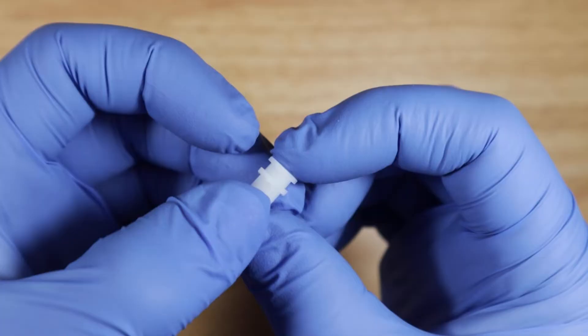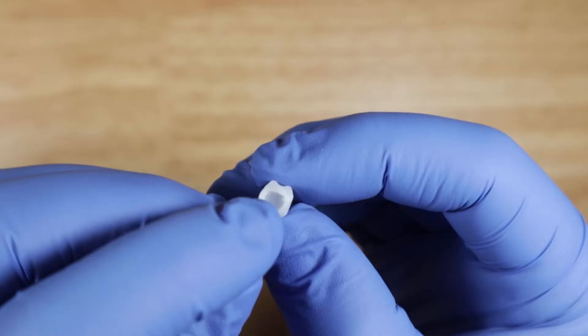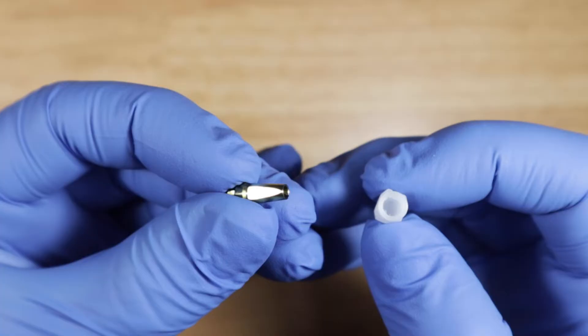Here is the little white cap. This white cap is going to be popped on top of that closed tray impression coping. On the inside, it's got one flat end that corresponds with the flat end on the cylinder.